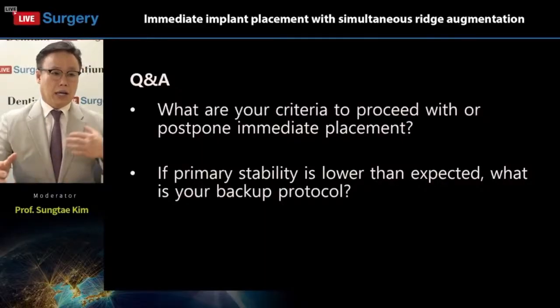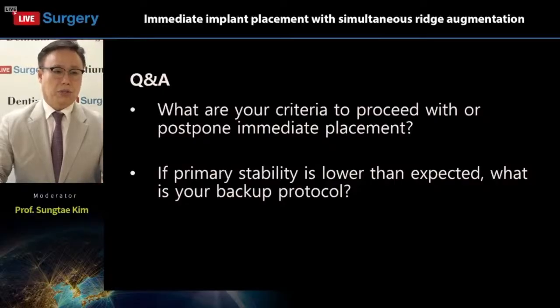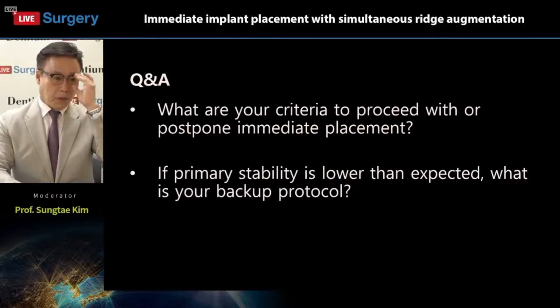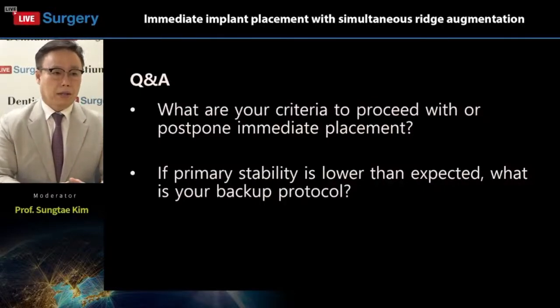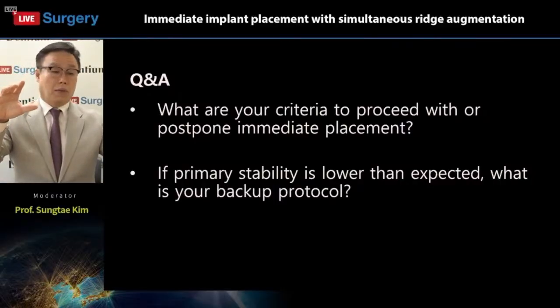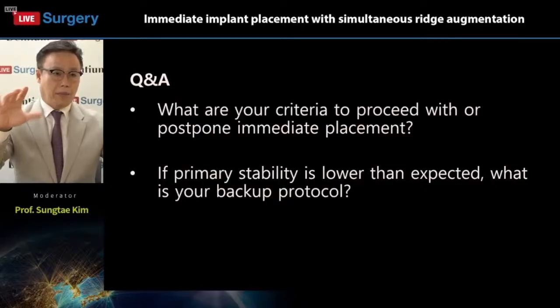The reason why I am introducing this technique, vestibular incision and immediate placement, is so you can think about the advantages or disadvantages of the vestibular incision. Those are two different protocols with a lot of scientific evidence.